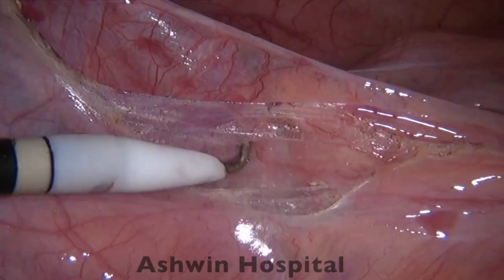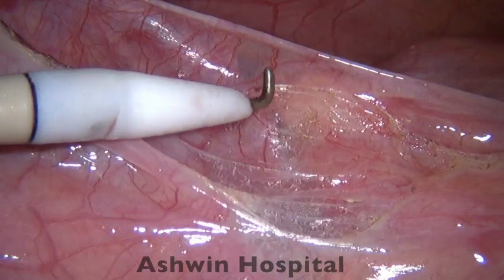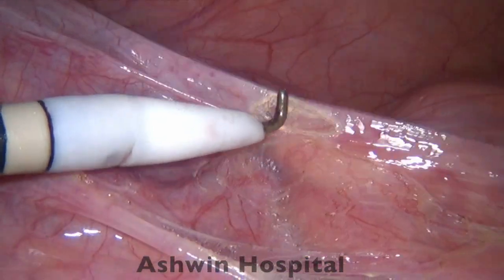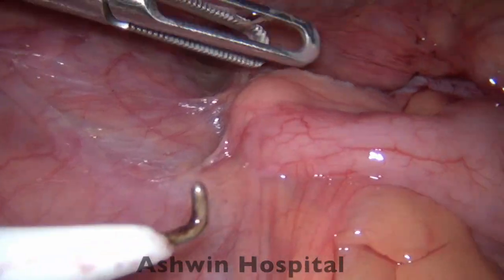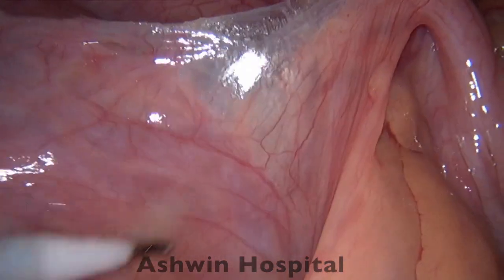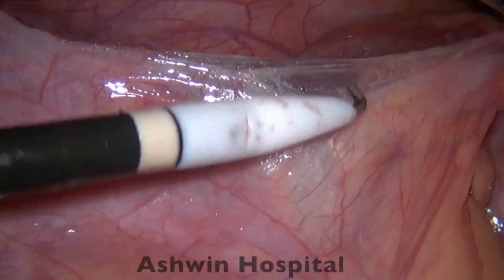When you give very good traction, the moment you incise the peritoneum you can see the carbon dioxide is nicely opening up the planes and showing us the exact area where we should be dissecting. We are able to dissect in a sharp manner with just a simple monopolar cautery — you do not need any sophisticated instruments for these dissections. Once again, coming a little more inferior, we identify the ureter and its exact course, then use the cautery in short bursts.